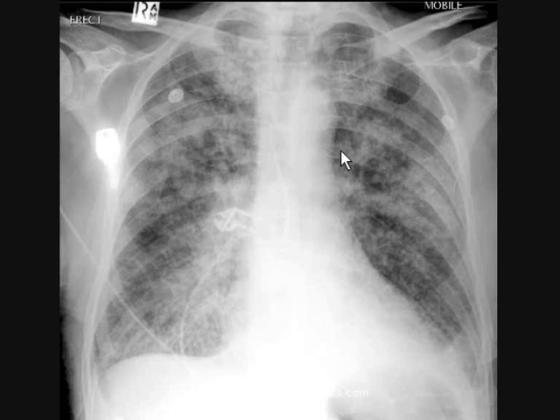Pulmonary edema refers to leakage of fluid from pulmonary veins into surrounding tissues, which initially happens around vessels, which decreases the clear definition of vessels in the early phase. Later on, fluid enters into the alveoli of the lungs, causing ventilation perfusion mismatch. Actually the ventilation perfusion mismatch happens as soon as fluid enters the interstitium, because diffusion cannot occur.